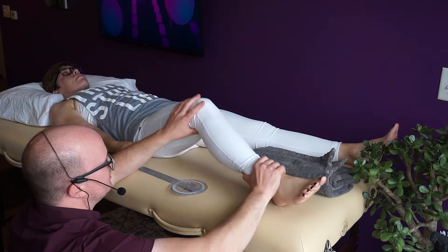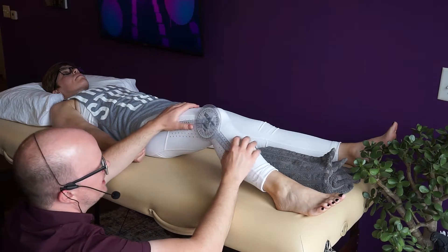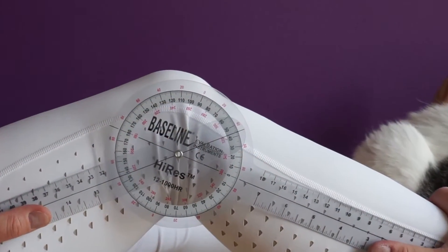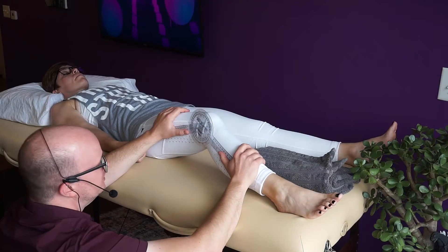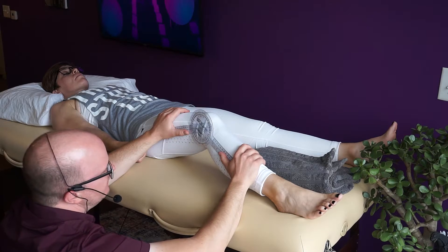Let's imagine she has a knee flexion contracture and that's where she started. I line the goniometer back up — she's stuck here, already at 44 degrees on the goniometer. So she has at least 44 degrees of flexion without doing anything. They get credit even if they have a contracture.